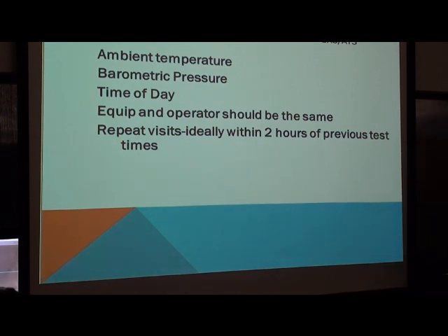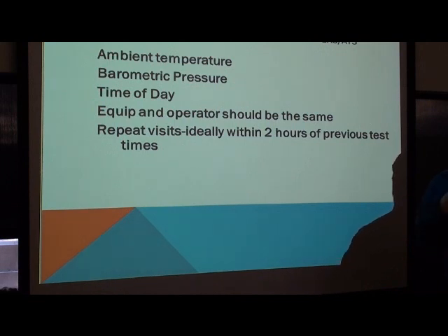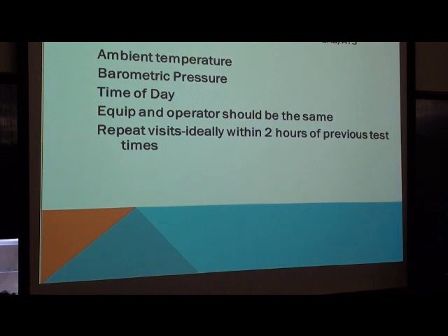We really don't want doctors saying, oh, you know, I think this guy would do well for surgery. I'm doing a pre-op clearance. Could you test him on system number 5? I know that gives higher results. That's not a good laboratory situation to be in. And so as far as operators go, we know it would be darn near impossible to schedule a patient visit with the same operator in this laboratory or any other. Many of you move from laboratory to laboratory to help us with our coverage.